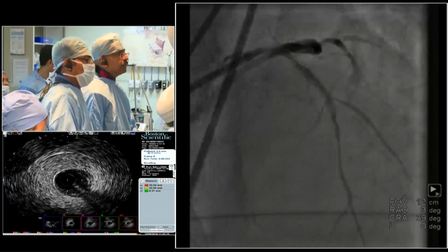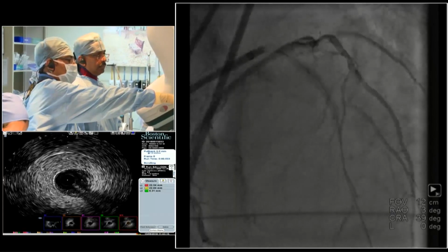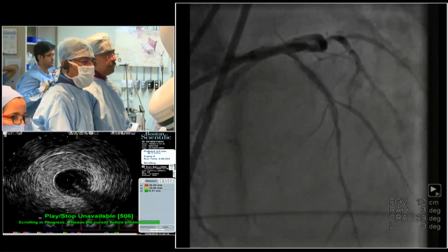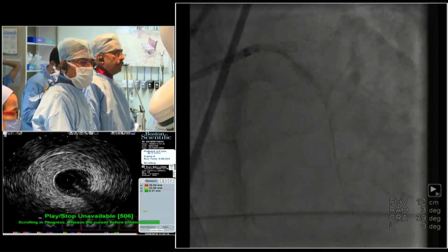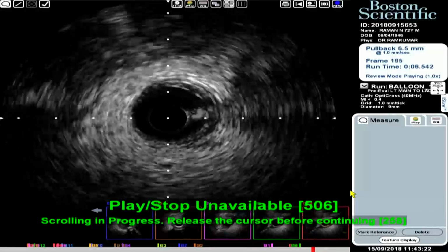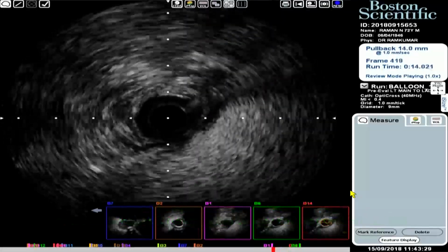If you see that angiographic picture, we started our IVUS imaging just above the bigger septal. Can you see the bigger septal distally? That is where we started our IVUS imaging. Yeah, just start playing now. Can you see there? This segment looks all right, just above the septal branch. The vessel size is about 2 millimeters. You can just see the 2 grids. And here, if you see carefully, the vessel is intramyocardial.